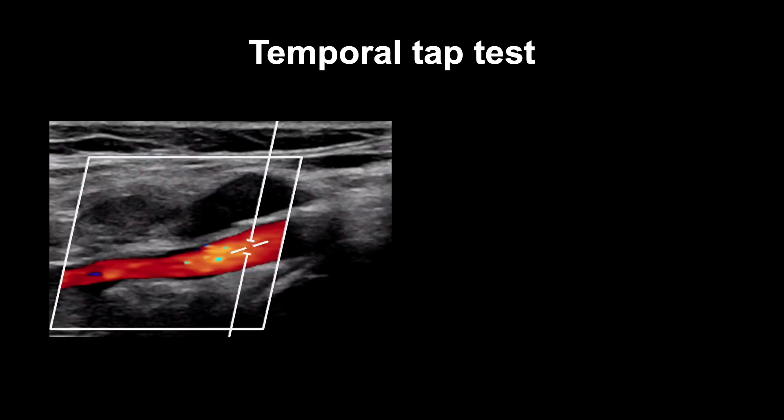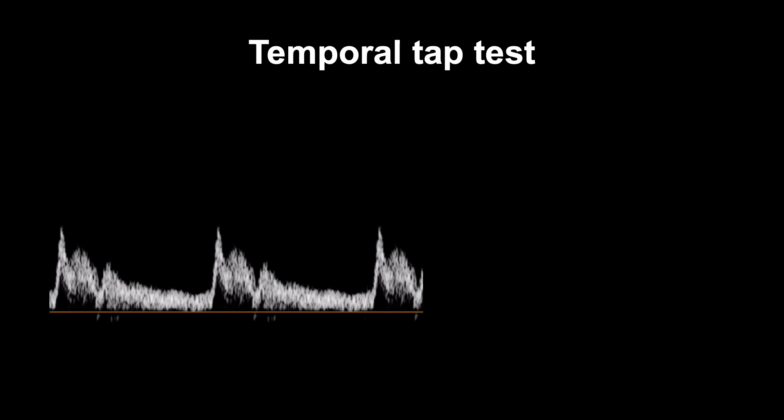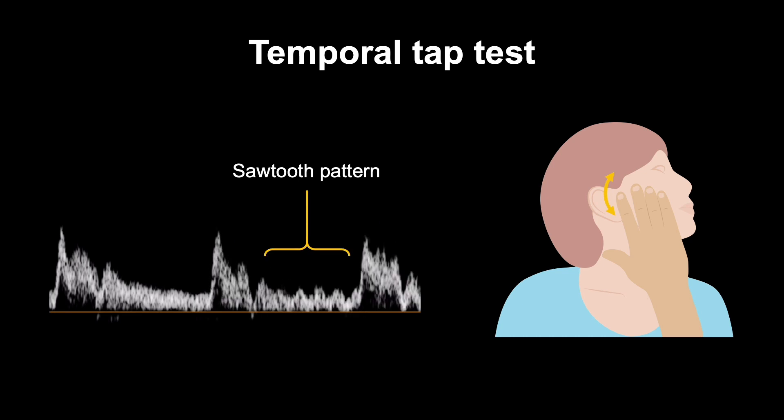In these situations, the temporal tap test can be used to help identify the ICA. To perform this test, position the Doppler sample volume in what you think is the ICA and switch on the Pulse Doppler. Once you have a clear pulsatile waveform, use a finger from your other hand to locate the temporal artery in front of the patient's ear. Lightly tapping here while keeping the probe very still should produce a sawtooth pattern in the ECA waveform, but will have no effect on the ICA waveform.